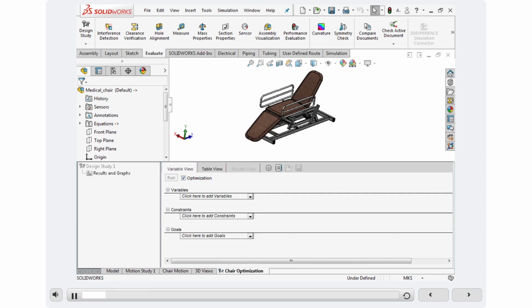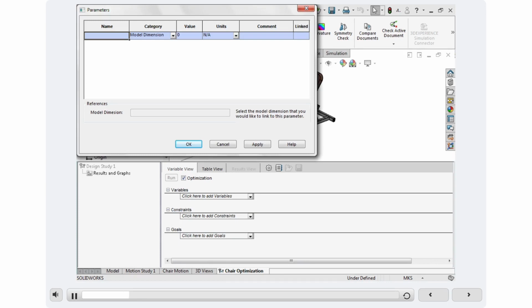In this optimization analysis, we will specify three variables. These three variables will control the lengths of the various linkages under the chair. These lengths are currently controlled by global variables. Now, we will define the variable and its values. In the Variable view, under Variables, click the drop-down arrow and click Add Parameter. The Parameters dialog box is displayed. Under Category, click the drop-down arrow and click Global Variable.